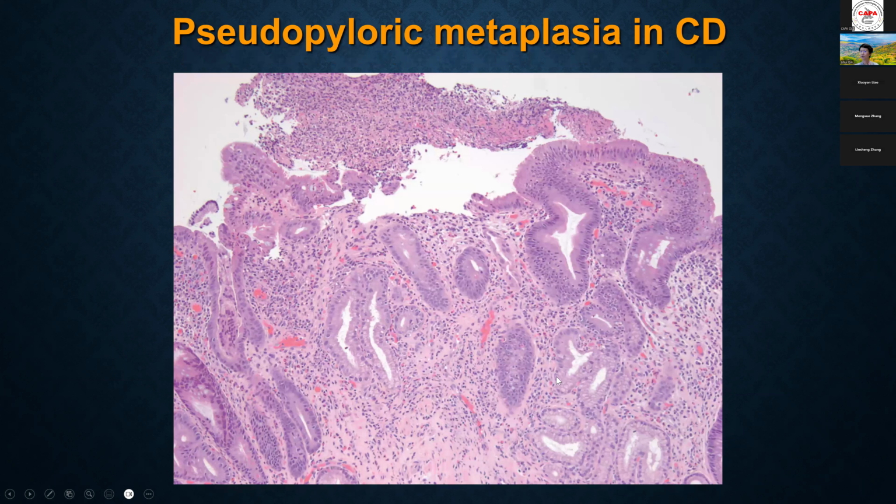And you may see pseudopyloric metaplasia. You see this group of crypts. The nuclei become much smaller than the enteric mucosa, and the cytoplasm is more pale. They don't have goblet cells. They look like the pyloric glands of the stomach. So once you see that in the terminal ileum and sometimes the colon, there's a chronic injury there. It may be seen more often in Crohn's disease, but by itself is not specific. And you may see ulcer on the top.